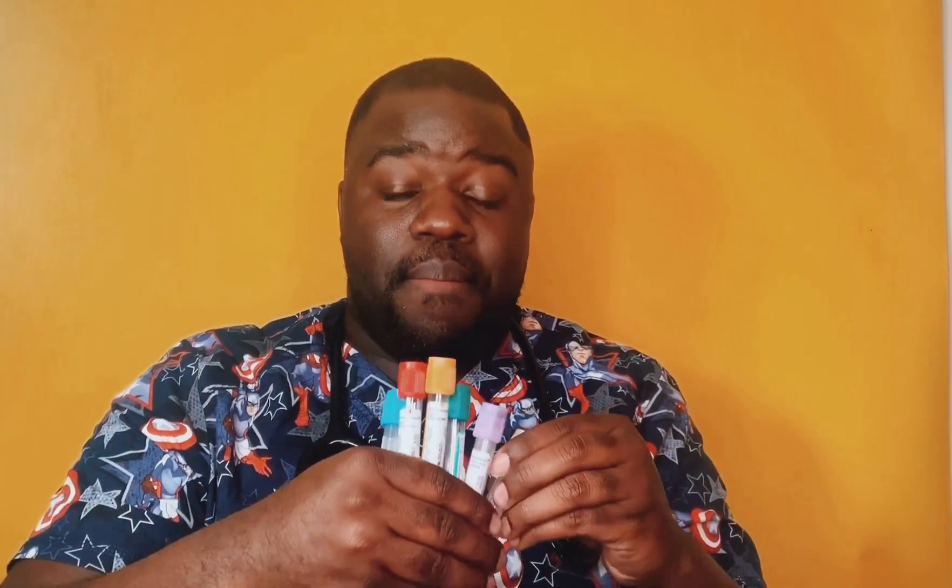So let's go in and kill it. Number one, we have our blue tube, our red tube, we have our gold tube, we have our green tube, we have our lavender, and then we have our gray tube.